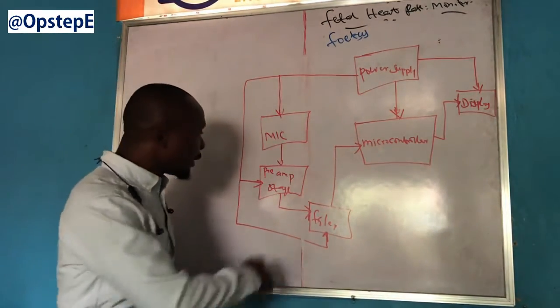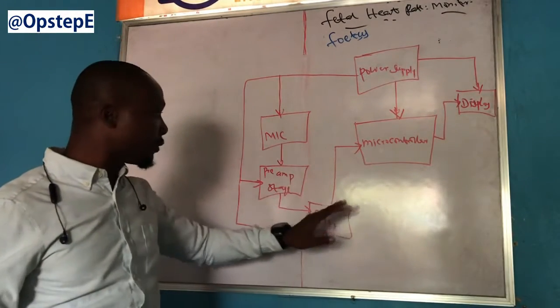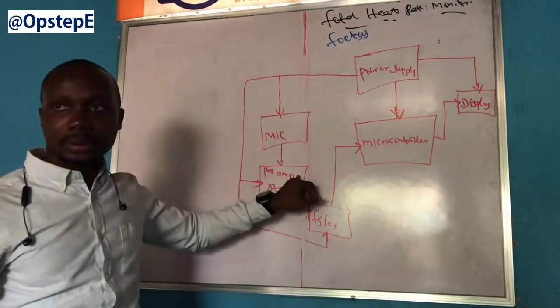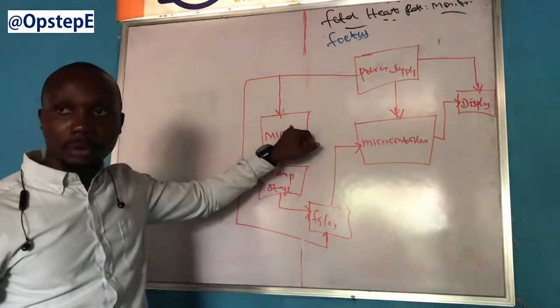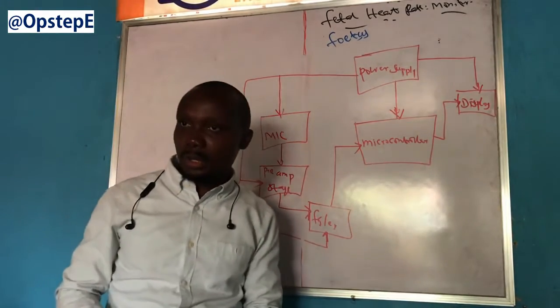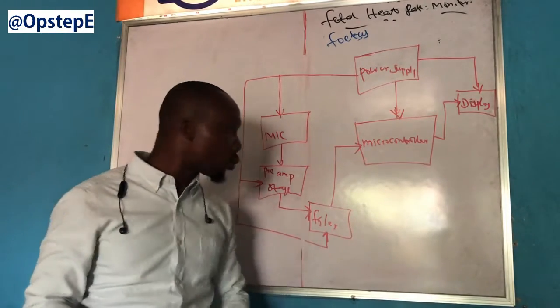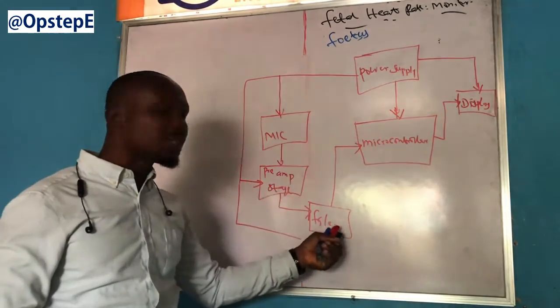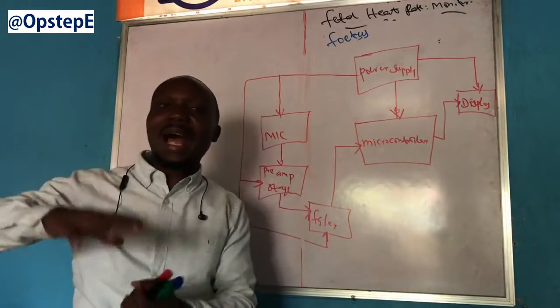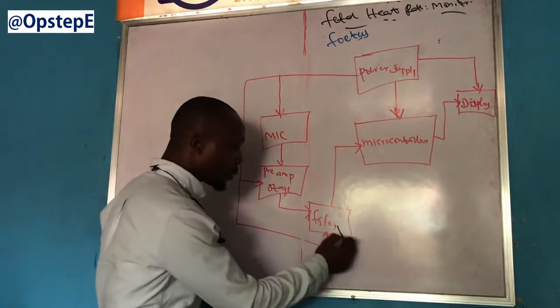Now, the essence of the filter is such that, and this is very important, what will be amplified, the signal from the microphone into the preamplification stage, will be both noise, surrounding noise, and any sound it's picking up is what is going to be getting here. The essence of this filter is to help us remove any signal outside 200 Hz. That's the essence. Let me put it down.